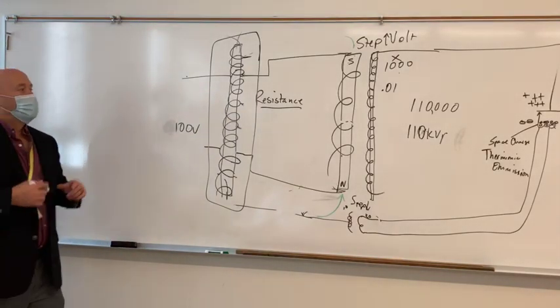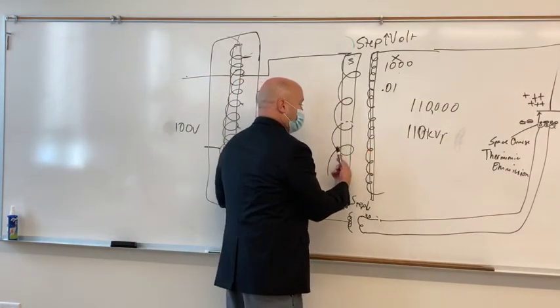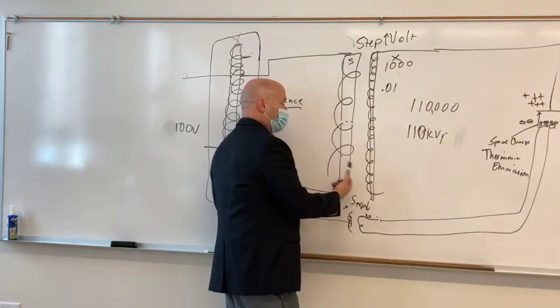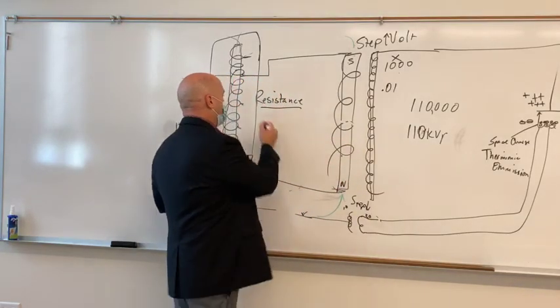All right. Other things are that we've still got some of these little spinny magnetic fields around the wires themselves, and that's what we call eddy current.